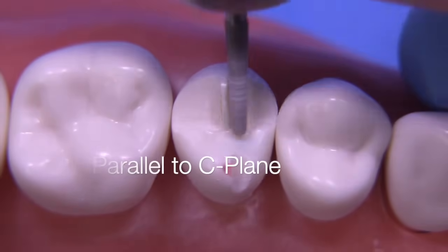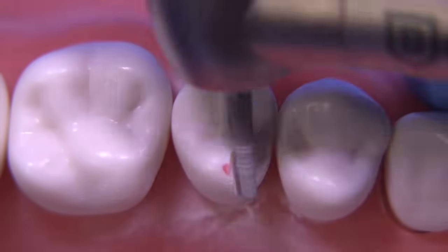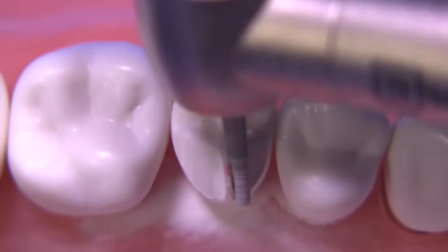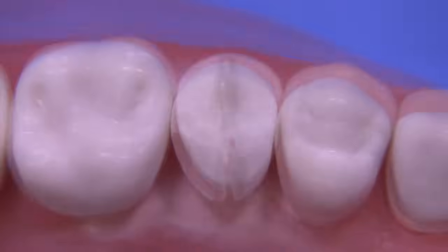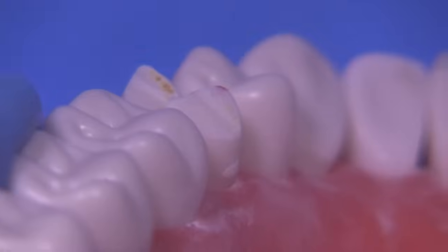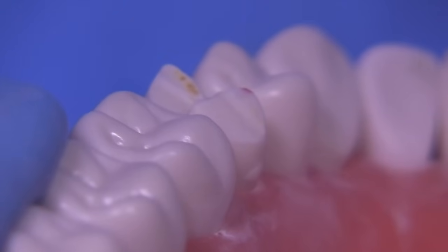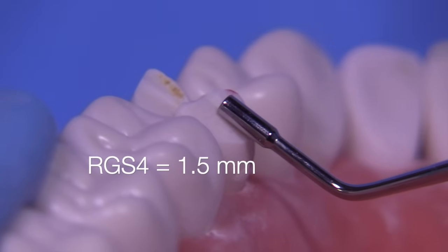We'll now start with the functional cusp bevel, or the A-plane, parallel to the C-plane for the most part. You can see how the tenons are providing a nice reference on how much tooth structure has been removed — it's a little bit like using a preoperative putty guide that you've cut in half sagittally or in the buccal-lingual direction.